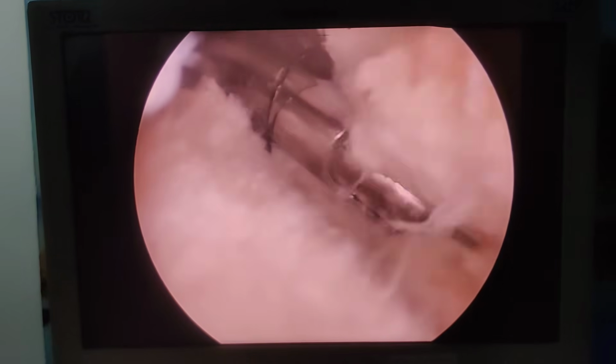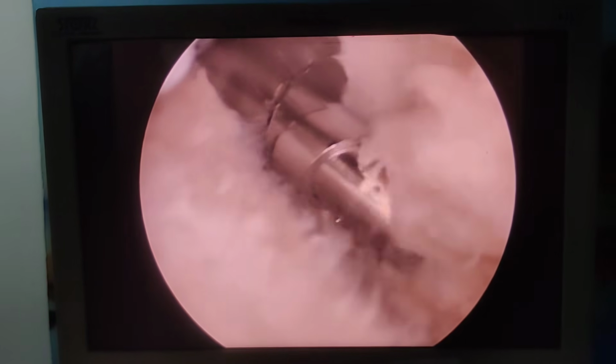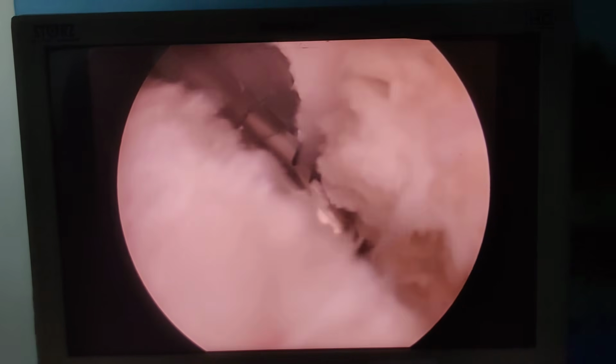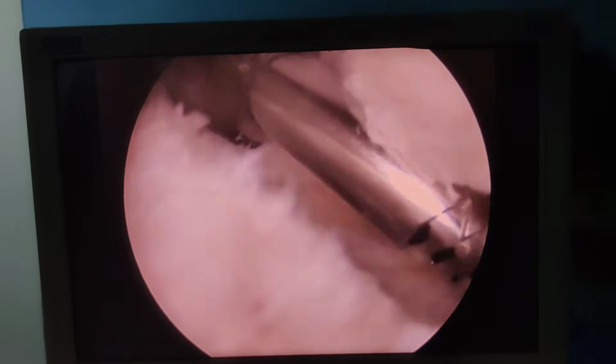But the key is, can you stop the shaver please? Never ever shave in this direction, because this is dangerous. In this direction you can, like this, but never like this, because then you don't know what you are shaving. So can we start again please?